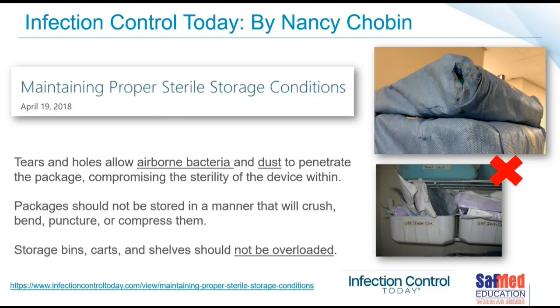And if you look at the examples of the pictures that I have over there, those are all very sad circumstances. Now, that particular pack, the one on the top, I found that outside the operating room about to be used on a patient. The one at the bottom, I've long since forgotten where I took that photograph, but as you can see, it's some plastic containers that some sterile stock came in that somebody's now tried to reuse. It's really flimsy, it's really clumsy, and there's so much stuff that's been shoved in there that's really and truly not ideal storage conditions.